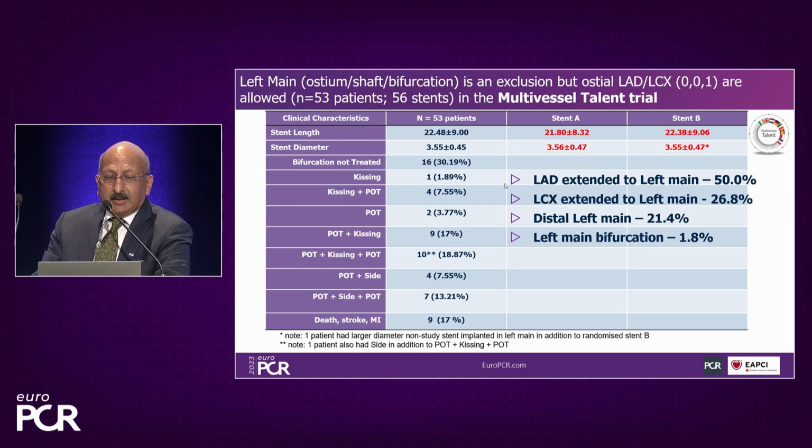So here you can see that most of them, the LAD extended to left main, which is a very common thing. And this is what we are addressing today: if we extend these stents, how far we can go with the expansion limits, and then how much we retain the strength of these stents and the outcomes.